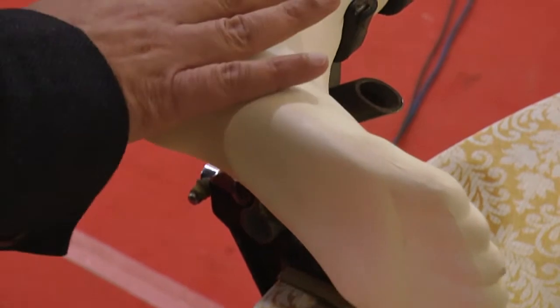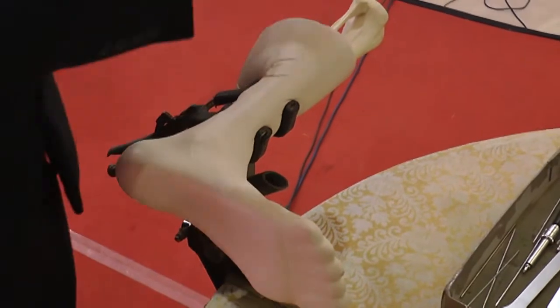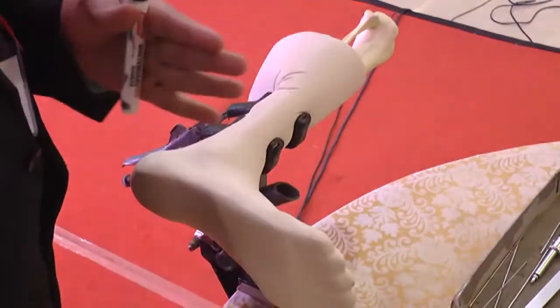So the position is lateral, the surgeon is standing on the heel side, the assistant is on that side, and as Dr. Rajiv explained, your C-arm is on this side, which is obliquely placed. So if this is the table, the C-arm is placed obliquely at an angle of 45 degrees to the table.